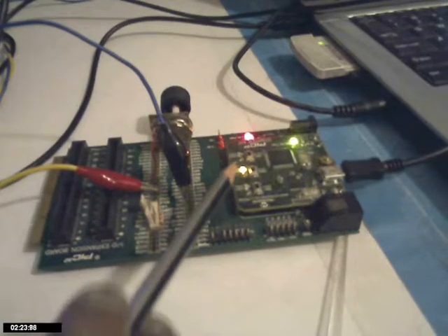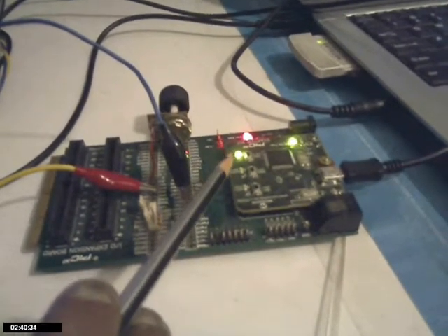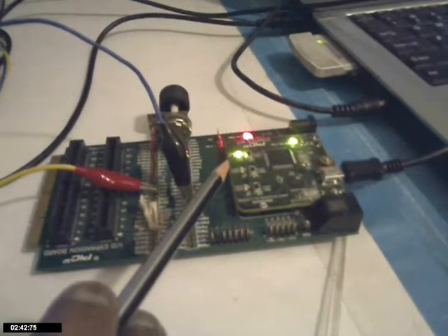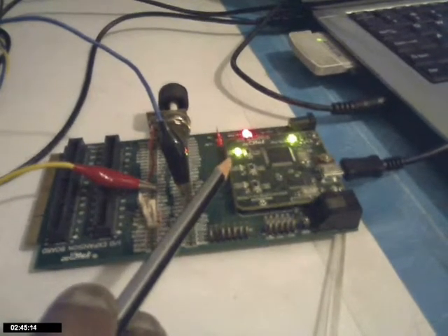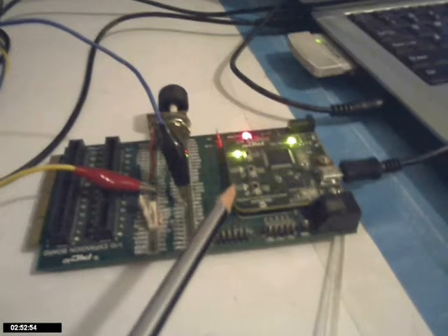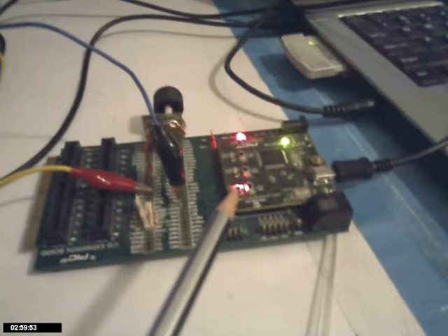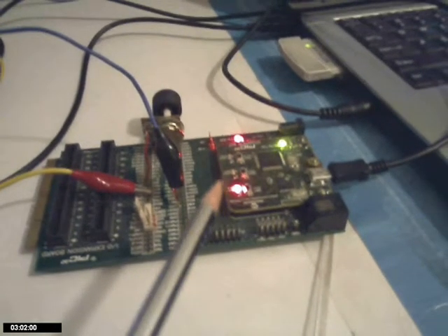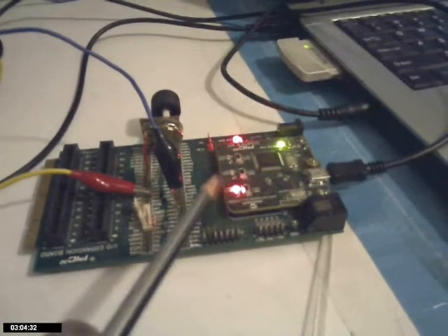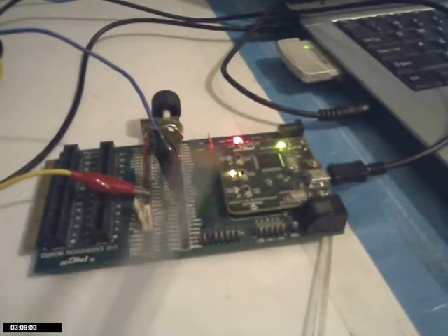Now we try to slow down the breath and see what happens. The left LED, that's green in color, glowing, it shows that the breath rate has gone down below the lower limit. And when you breathe faster, you're going to cross into the red limit. Here comes up red, which means the breathing is out of the normal range. And when you're back to normal, you're going to see the orange LED come back again. So that's what the PIC32 is doing over here.